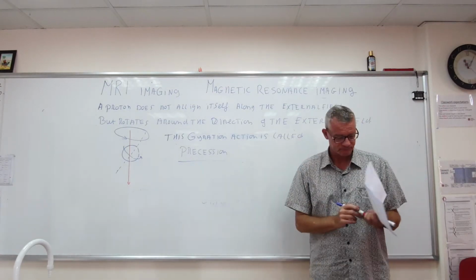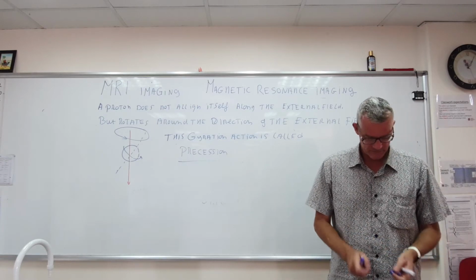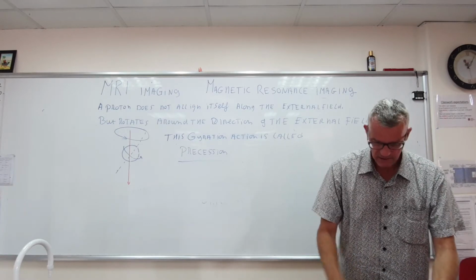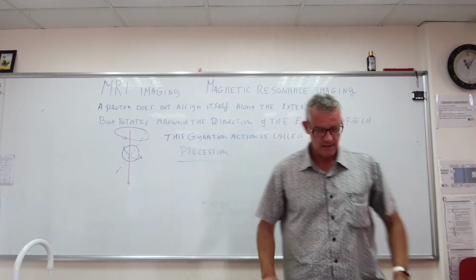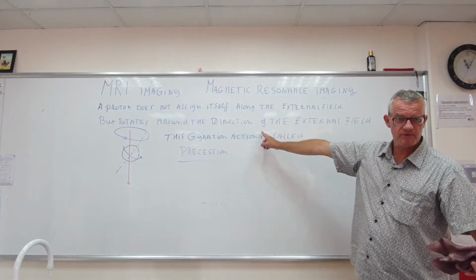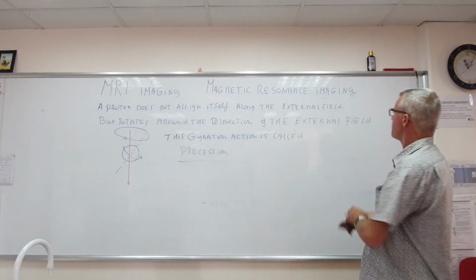Okay? Now I'm going to show you a small video of how precession more or less works. Okay? So make a small note of this, pause the video.